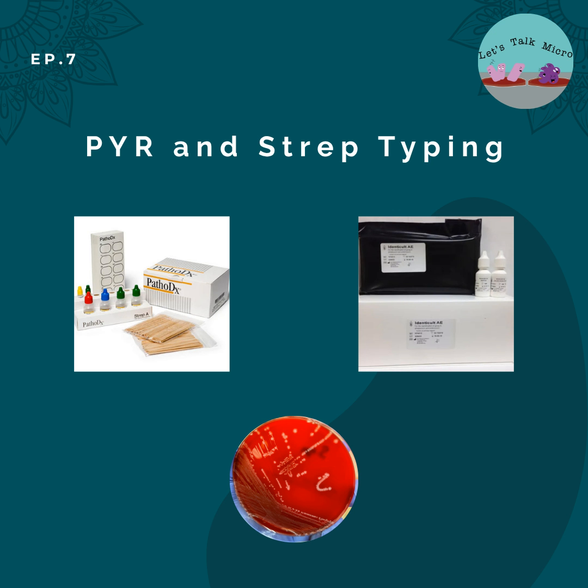So go ahead and look at the flow chart for the organisms, but I'm going to say them again. Group A, Strep pyogenes. Group B, Streptococcus agalactiae. Group C, Streptococcus dysgalactiae or Streptococcus anginosus. Group F, Streptococcus anginosus. And Group G, Streptococcus dysgalactiae and Streptococcus anginosus. And that's just based on the Lancefield system.